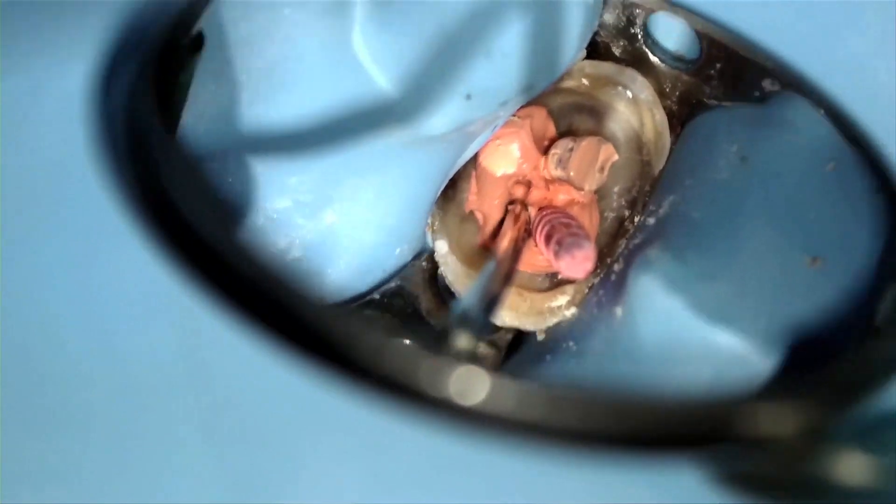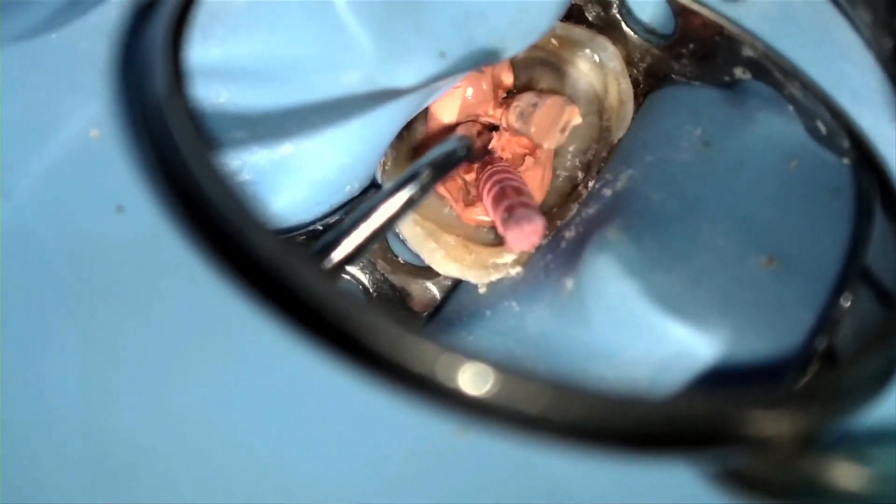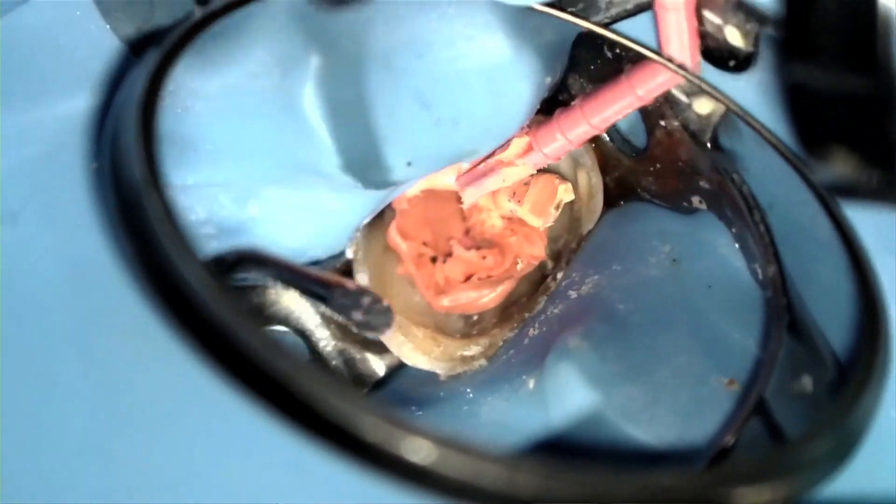This is optional, but in large canals, as you may see in this clip, I like to down-pack the warm gutta core gutta percha around the cold gutta percha in order to provide an even better obturation.